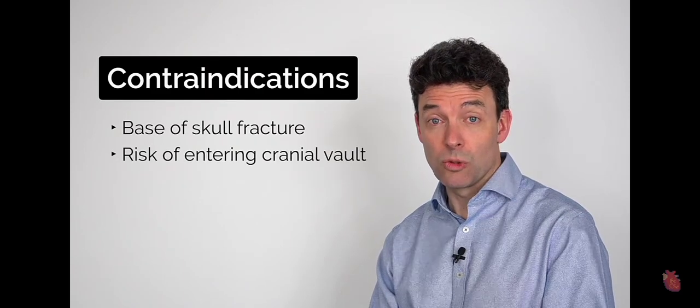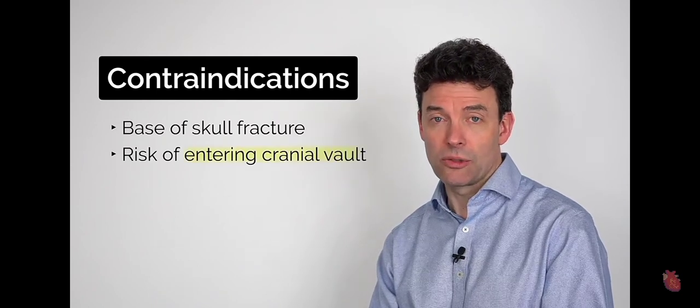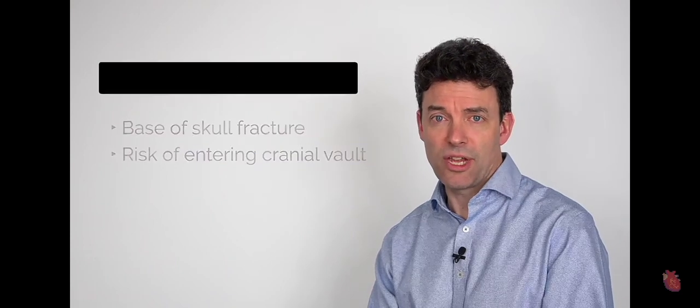Base of skull fracture is a relative contraindication to inserting a nasopharyngeal airway. This is due to the small but potentially life-threatening complication of the airway going into the cranial vault. This risk must be balanced against the need to protect the patient's airway.